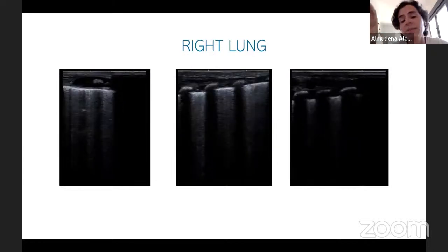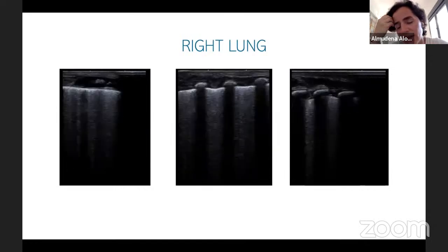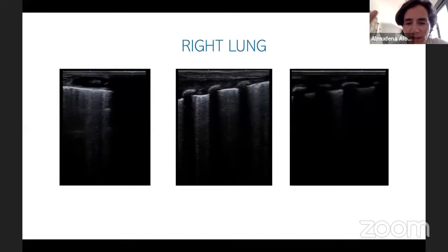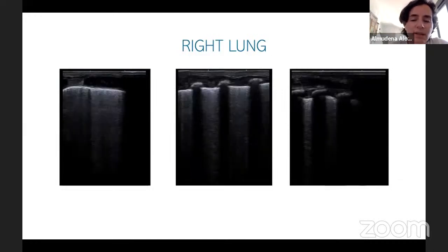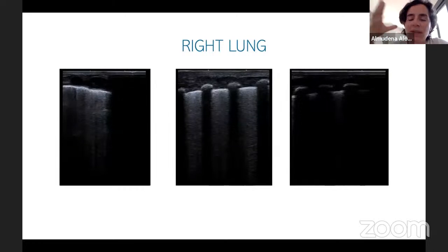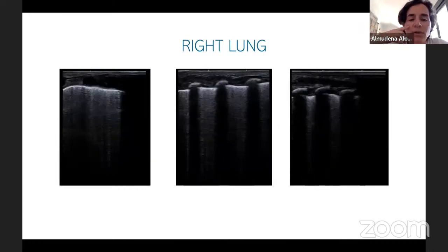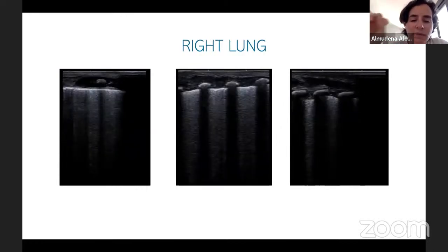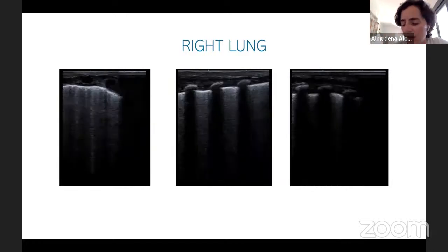So maybe this pattern should have made us wait and try not to extubate this infant, which we didn't do because we were kind of beginning at that moment. And we extubated him, and the attempt failed just 10 hours afterwards. So this is more or less what you can do with your exams and some other information that you can have apart from just knowing if the baby has an RDS, TTN, pneumothorax, or whatever. Okay.